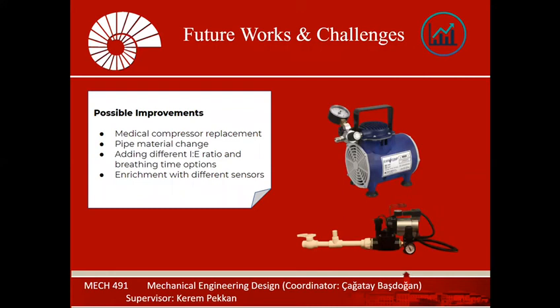Also, we designed our system using 3 different IE ratios and 3 different breathing times in our Arduino code. We offered 9 different options in total, and the number of options can be increased by developing the code.